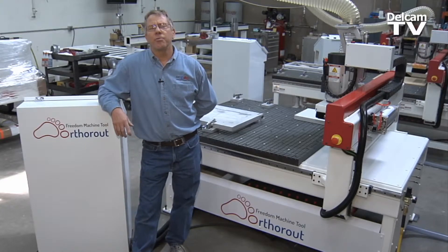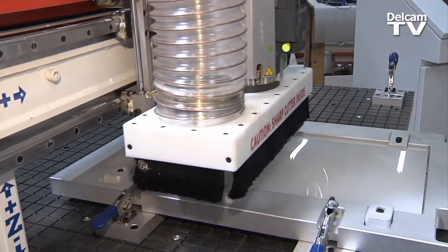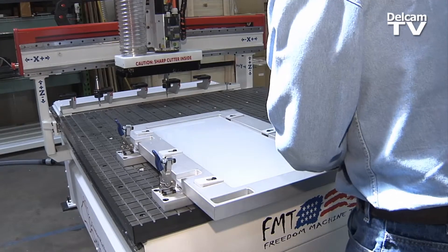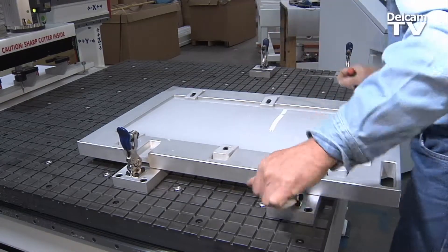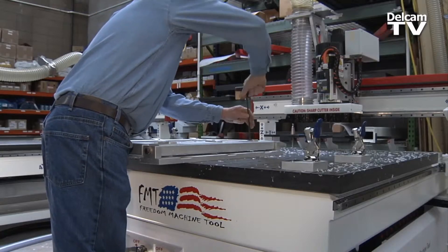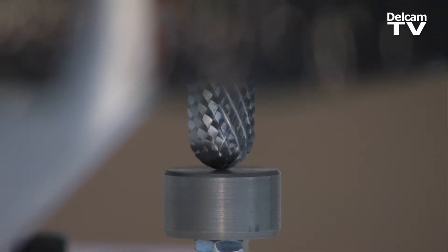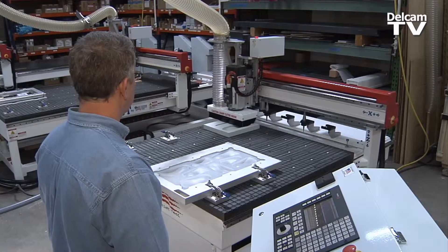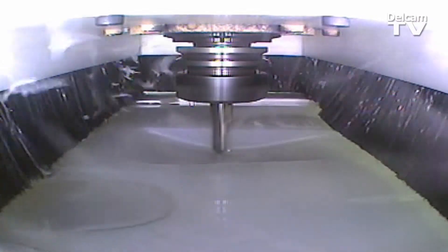The other machines that were out in the marketplace, a lot of them were bolt together type machines, did not have the rigidity to give you the smooth, clean cut that you're looking for in a nice 3D orthotic. The OrthoRoute we feel is a superior product for the weight of the machine, the mass, the structure. It is all welded steel frame. We do all the machining to make every surface parallel and perpendicular to where the accuracy is there for continued operation.